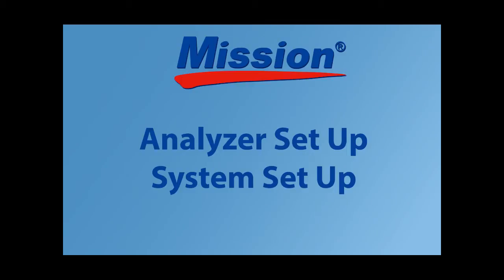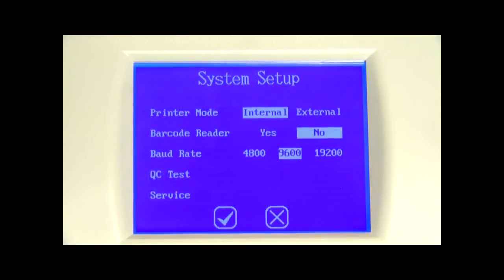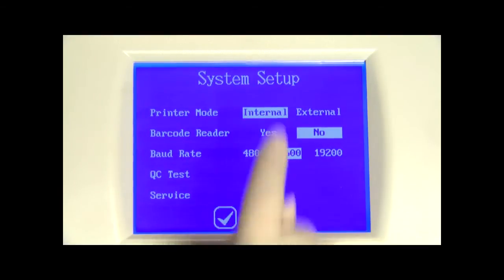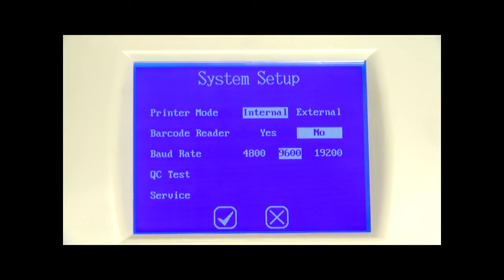To begin analyzer setup, press the system setup icon to display the system setup option screen, used to configure the printer, barcode reader, QC test, and communication options. Press printer mode to cycle the printer mode through internal and external settings — the selected mode will be highlighted. If internal is selected, all test printouts will print on the internal printer. If external is selected, all test printouts will print on the external printer if connected.